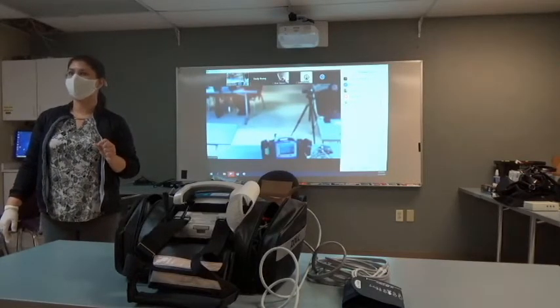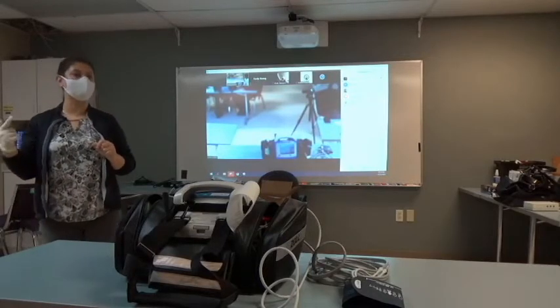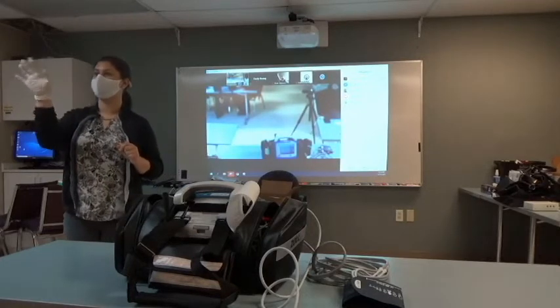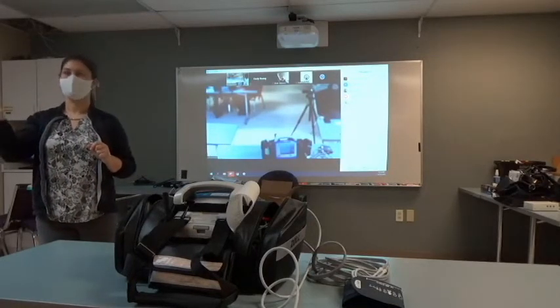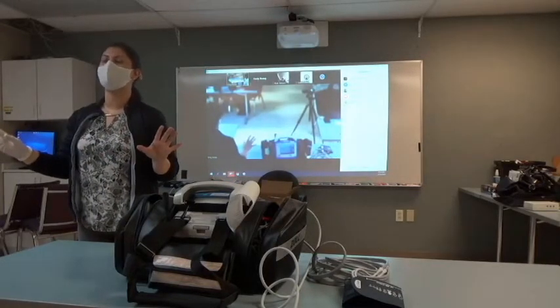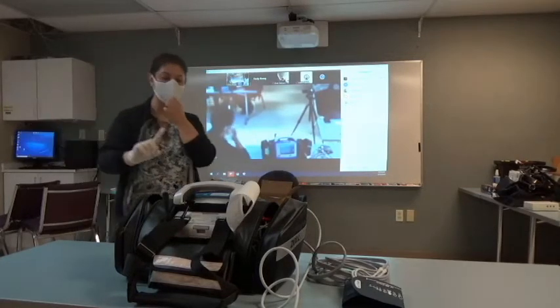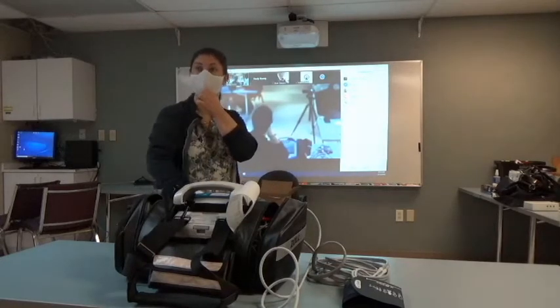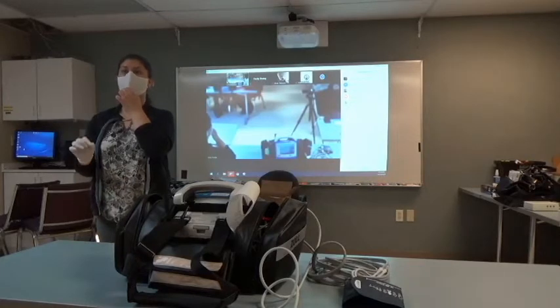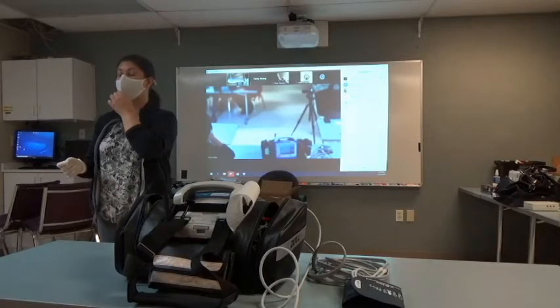Do you have any questions for me on how to acquire a 12 lead? How to place a name inside the 12 lead? Or how to flip through those double screens? Okay, if you forget everything I said about 12 leads, remember one thing, the number 12. If you just follow the number 12 on this device and keep pressing it, you're going to eventually acquire a 12 lead. It is very important to put the age and gender in for the interpretive statement, if your department requires that.